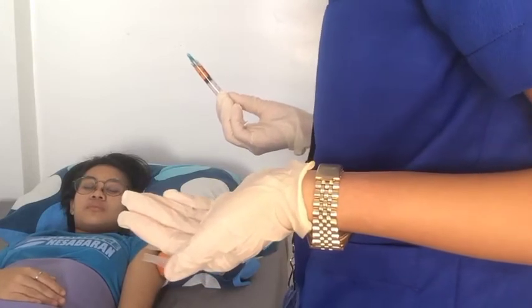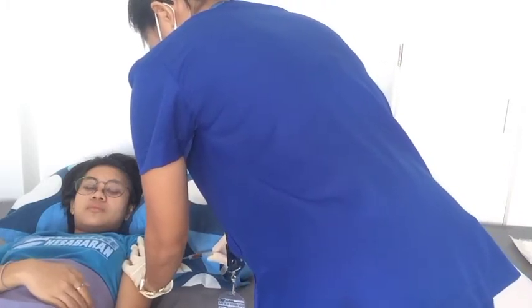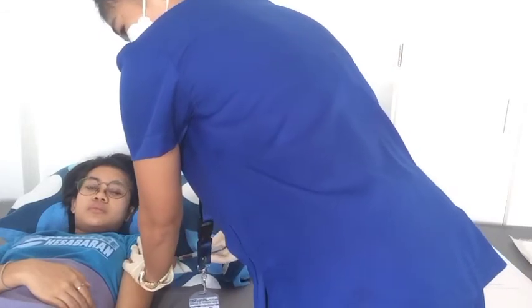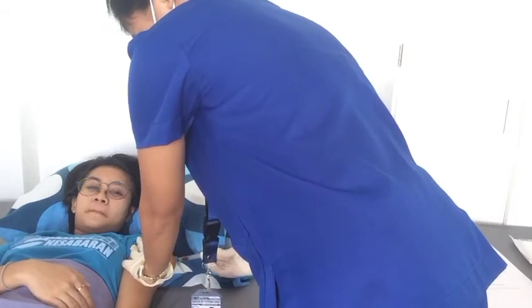Inject the medication using a Z-track technique. Use the ulnar side of the non-dominant hand to pull the skin approximately 2.5 cm or 1 inch to the side. So on the count of 3, ma'am, I'll inject it: 1, 2, 3. Are you ready? Yes. Okay, thank you. Hold the barrel of the syringe steady with your non-dominant hand and aspirate by pulling back on the plunger with your dominant hand. Aspirate for 5 to 10 seconds.